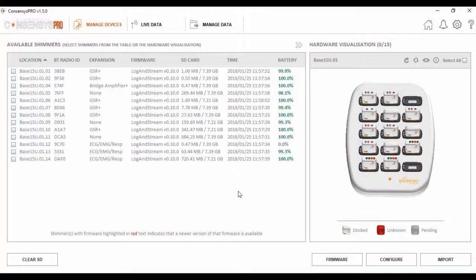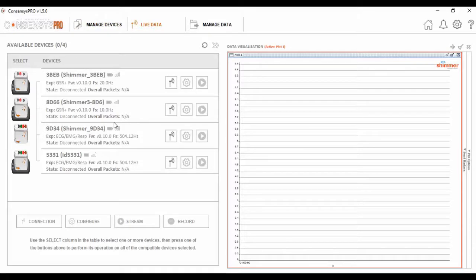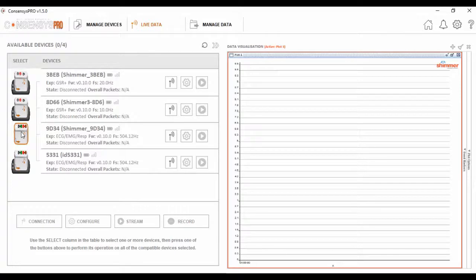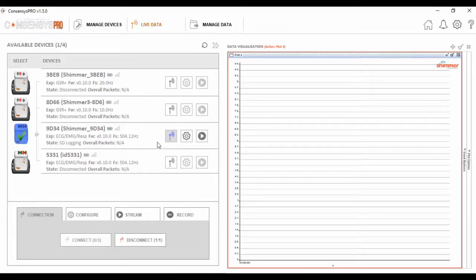Next, I'm going to introduce you to the Live Data tab on our Consensus software. This, as you might have guessed, is where live data can be visualized. The first thing you'll need to do is ensure the devices you want to stream data from are paired with your PC or laptop and visible in Consensus. Following this, we select the device we want to stream from, connect the Bluetooth, and once the Bluetooth connection is established, we can begin streaming signals from this device.